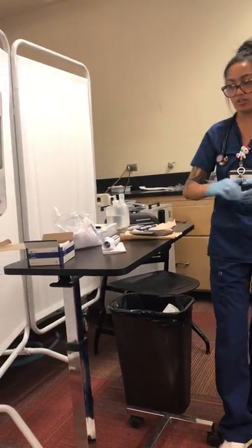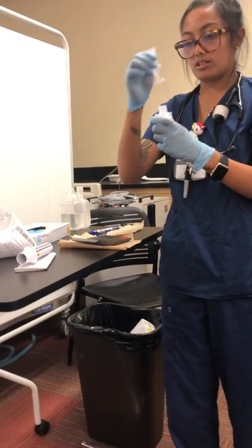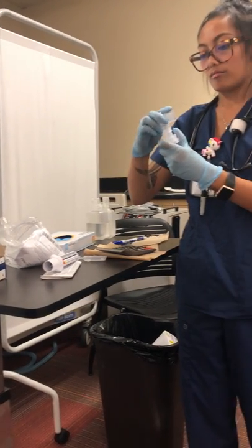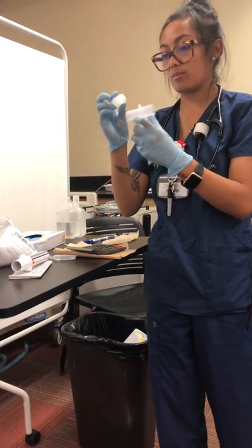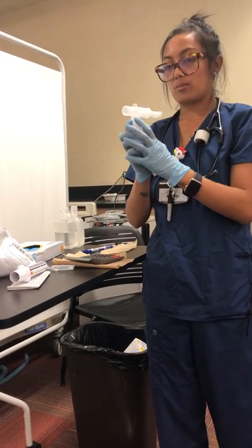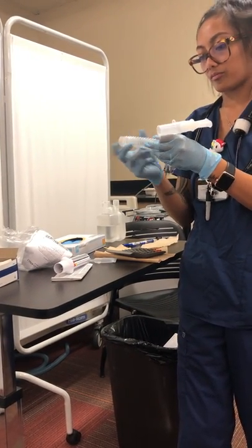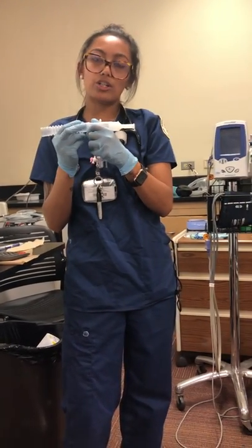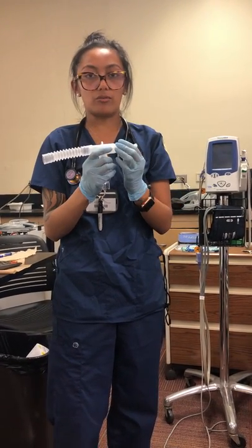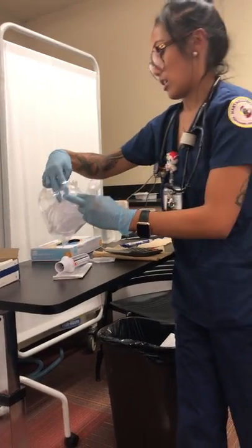I'm going to set up your small volume nebulizer. I'll take the nebulizer cup and put the medication inside of it, and set up the other pieces. We're going to use a mouthpiece — I'm going to attach the T-tube and mouthpiece — because the patient is coordinated enough to hold the nebulizer to her mouth and take the breaths in. I'm also going to attach the reservoir. If the patient didn't have the coordination, we would use an aerosol mask that we would just put onto the patient with little to no effort needed.